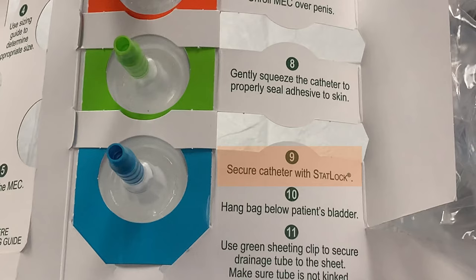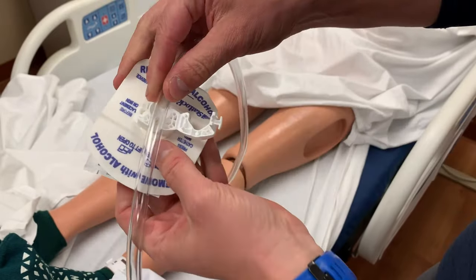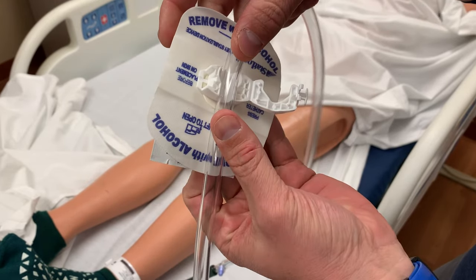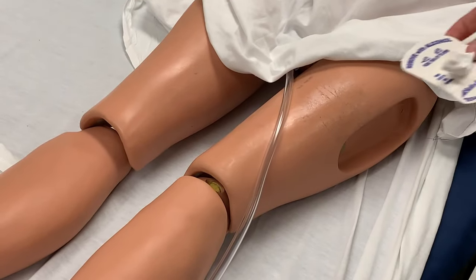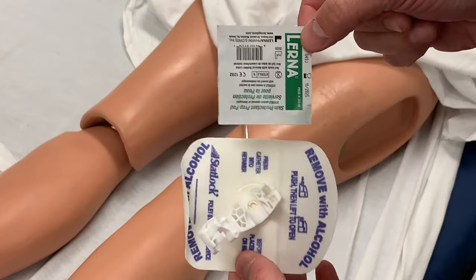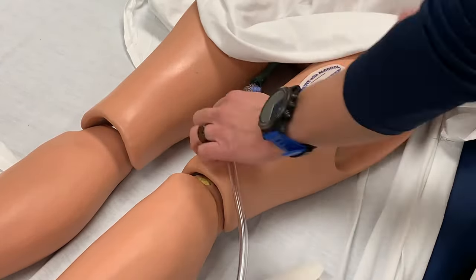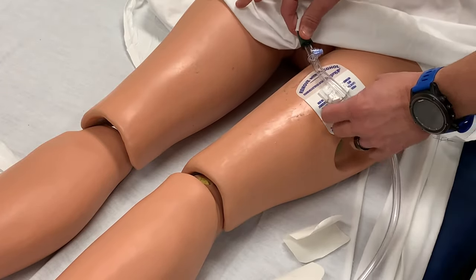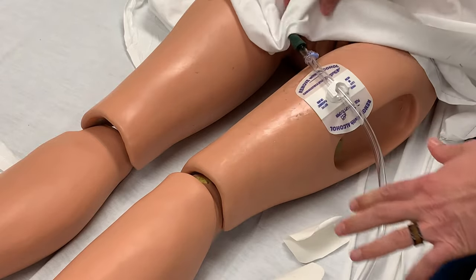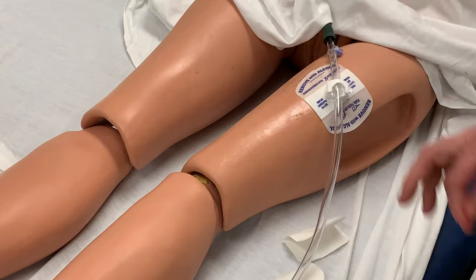Step nine is to secure with the provided stat lock. This is a different device than is used for Foley catheters. This stat lock has one straight opening on the clamp to secure the drainage tube, unlike the Foley stat lock that secures over the Y-shaped bifurcation in the tubing. The stat lock should be placed midway down the patient's thigh. Prepare the patient with a provided skin prep swab before adhering to the skin. With the stat lock in place, clamp the tubing into the stat lock. The catheter tubing should not be so tight as to pull the catheter when the patient moves, but should also not be so loose as to cause dependent loops between the stat lock and the patient.